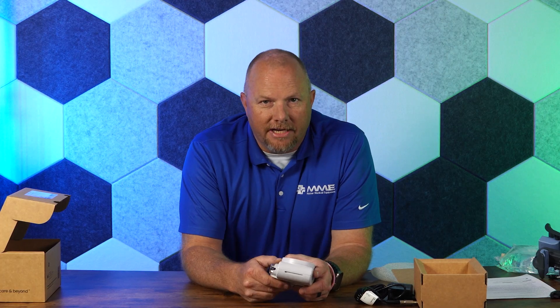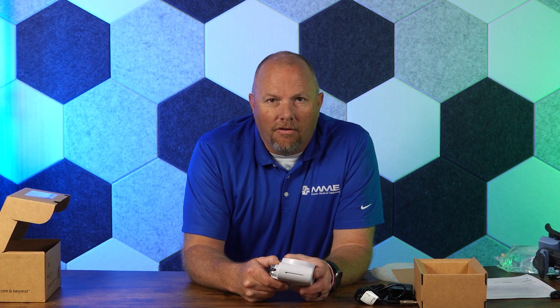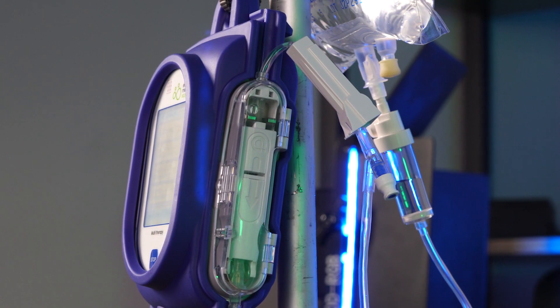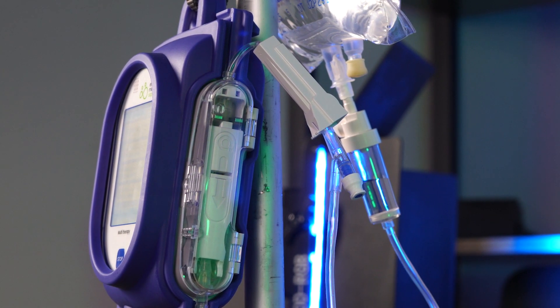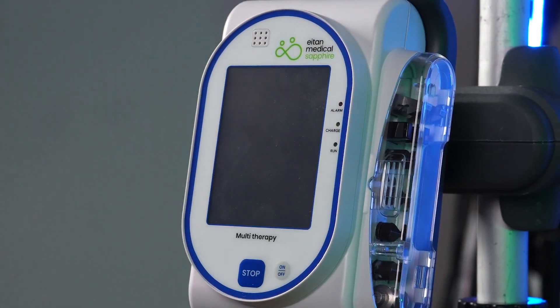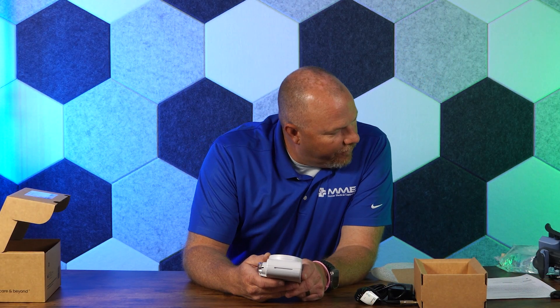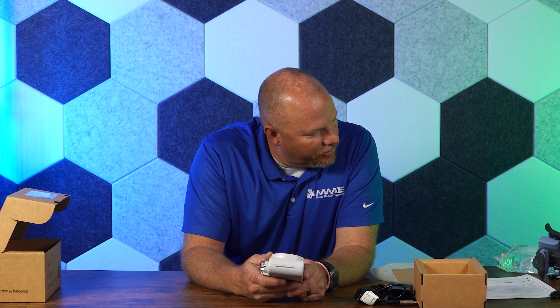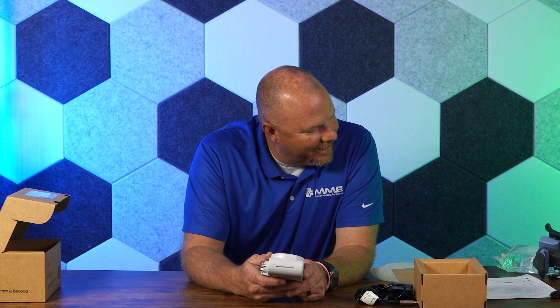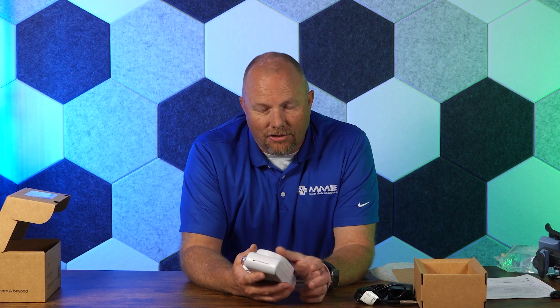It can even be used in the acute care setting and moved all over a hospital system with different clinical care areas delineated within the drug library. The Sapphire multi-therapy pump is one of only two pumps on the market that holds the IEC 60601-1-12 transport rating, which shows it meets requirements for medical electrical equipment and systems intended for use in the emergency medical services environment.